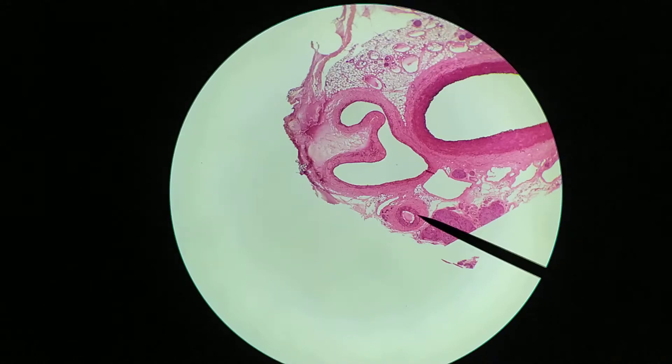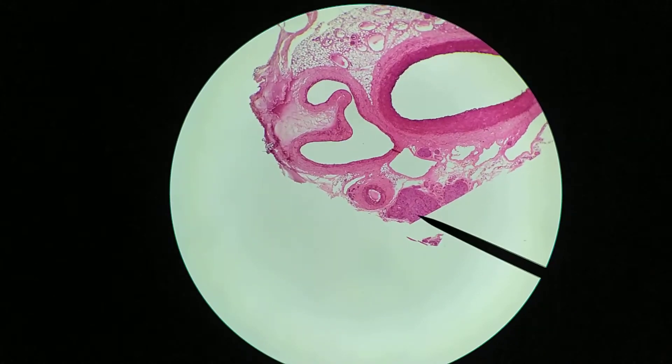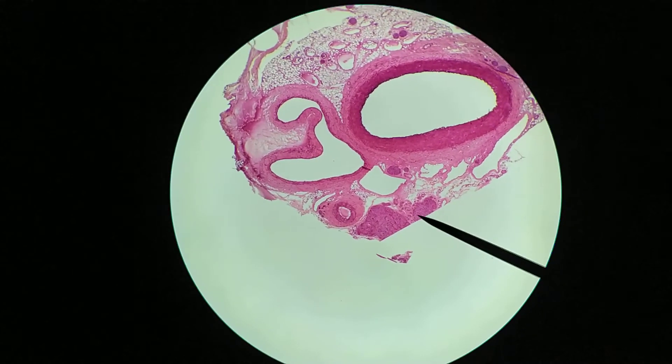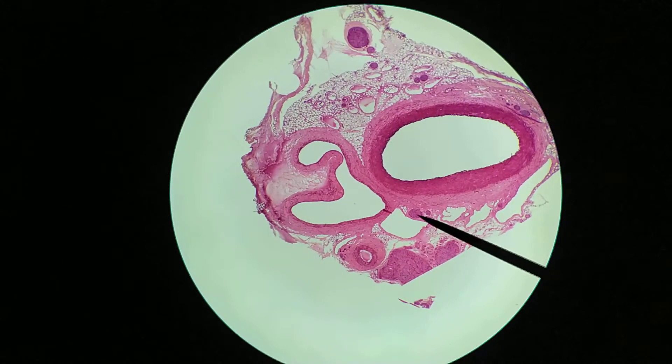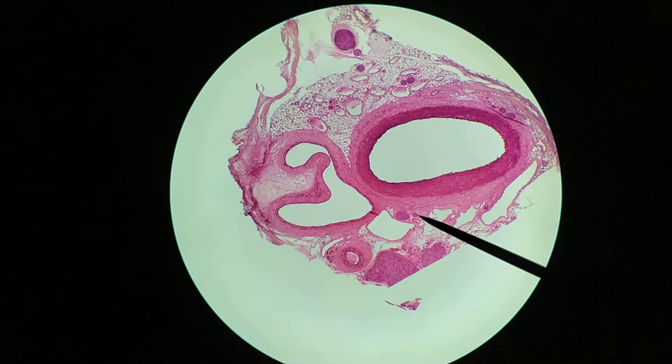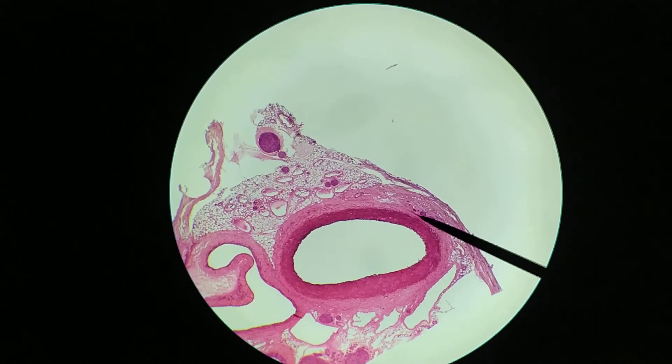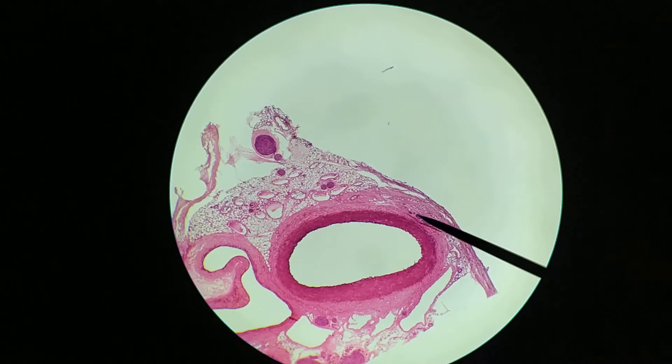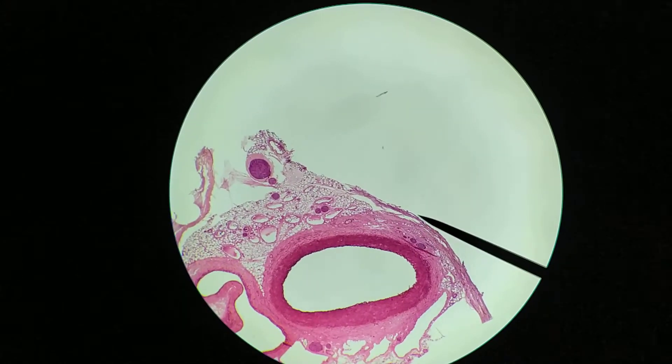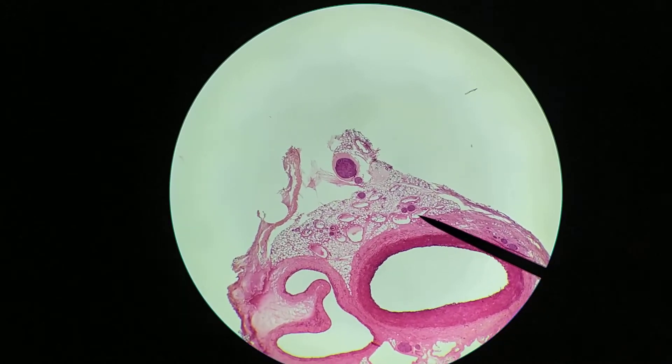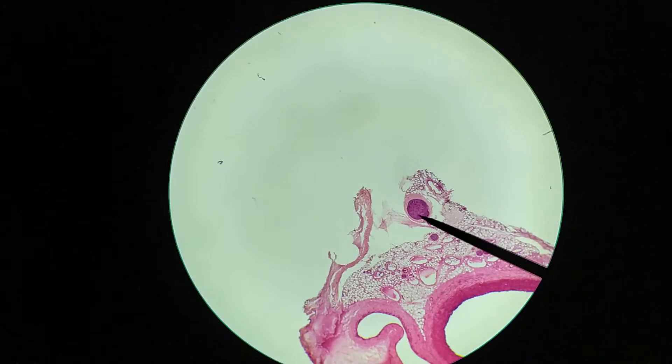You'll also find a few other structures on this slide. For example, this right here is a nerve. Here's another nerve. Here's a smaller nerve bundle here and here. There's two more just to the right of this artery, a couple more nerve bundles, a couple more up here, and a larger one up at the top here.